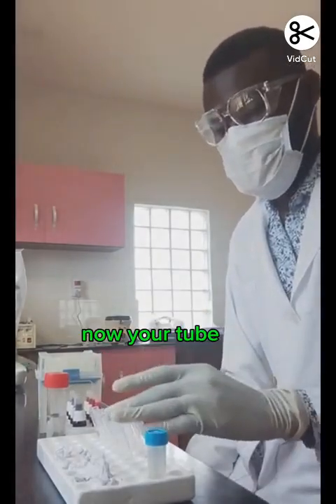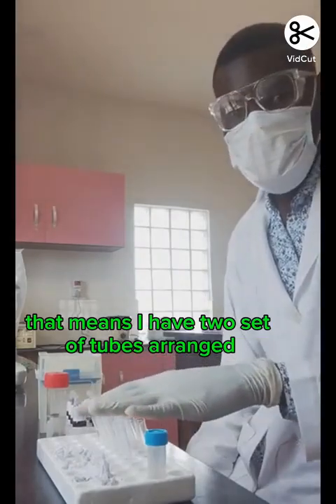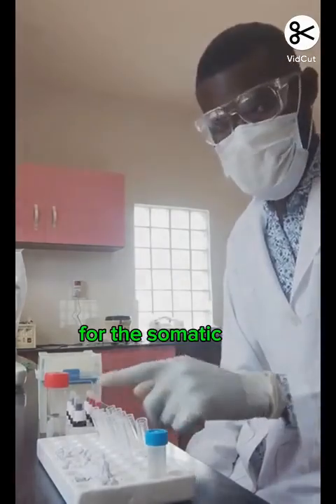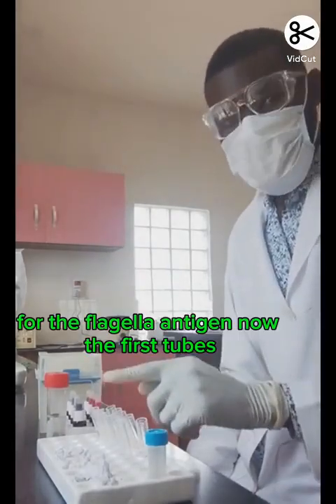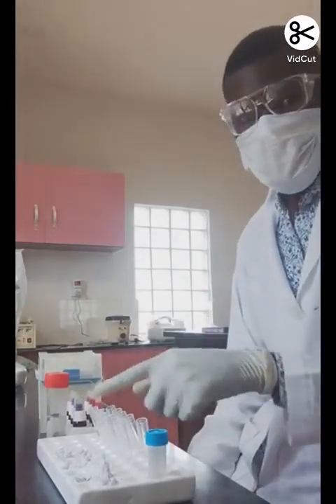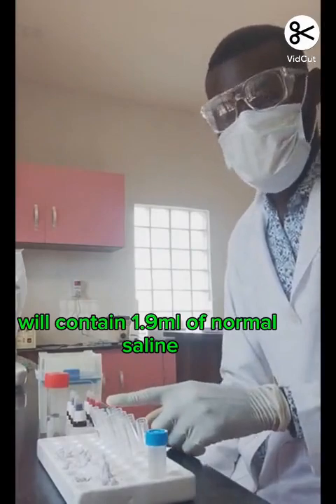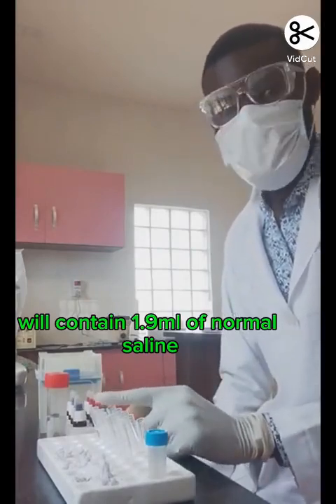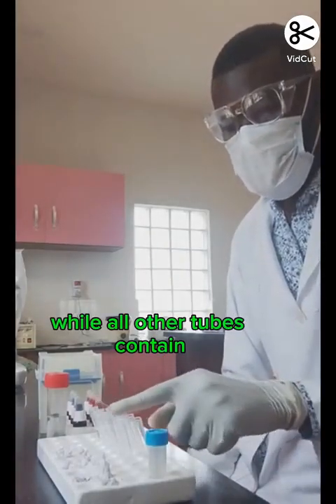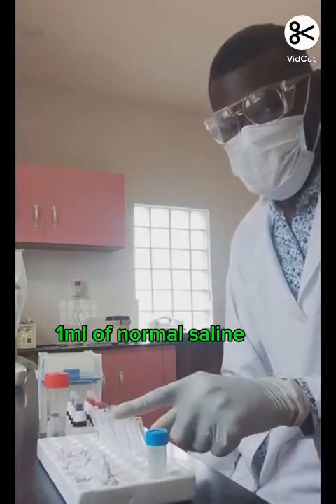Now your tubes, that means I have two sets of tubes arranged, one for the somatic and one for the flagellar antigen. The first tubes will contain 1.9 ml of normal saline, while all other tubes contain 1 ml of normal saline.